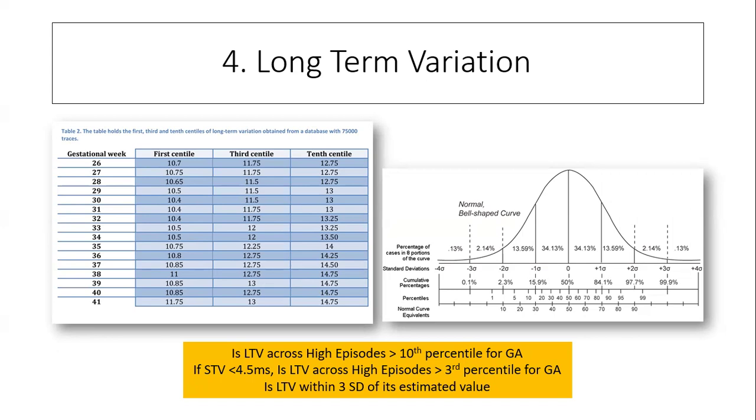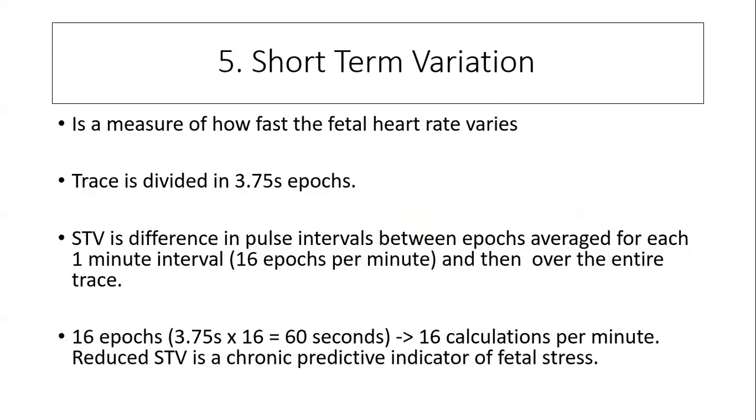So it means that it's quite low, and therefore the mean long-term variation didn't really have a lot of high episodes in it, and that's why it's quite low. So you need to continue the analysis because you're not really sure the baby woke up in that analysis.